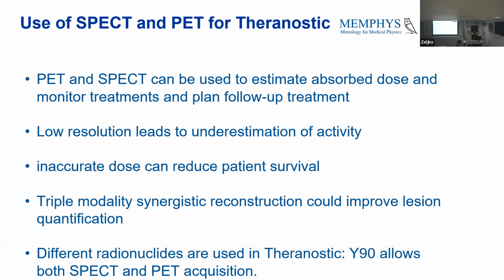So when we talk about theranostics, we think about a treatment for cancer where you inject a patient with a radiotracer that will travel toward the tumor. And then we can also take advantage of the radiation created to do imaging and so monitor the treatment. But you can also use a similar radiotracer to perform dosimetry planning. And so, yes, we can use PET-SPECT to do that.